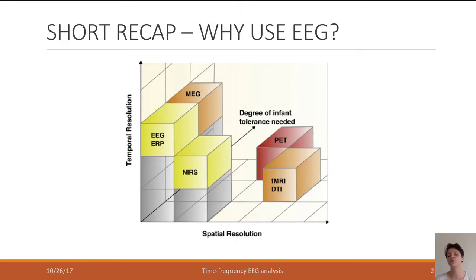While all these uses can be very valid, I feel that they completely ignore the most important aspect of EEG. You know about this aspect, but I want to press upon you more and more today that the temporal resolution of EEG is something incredible, and that we should use it to the fullest extent, so that you can come up with very specific paradigms in which you can only use EEG, which gathers us new types of information on how information processing is done in the brain.